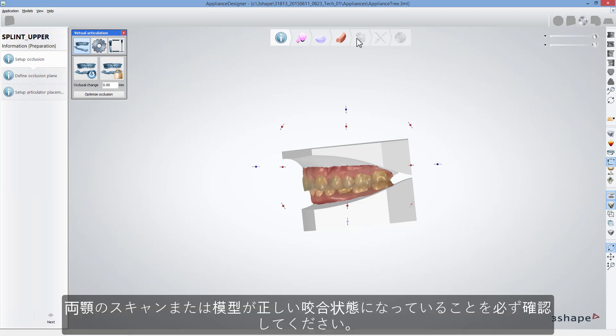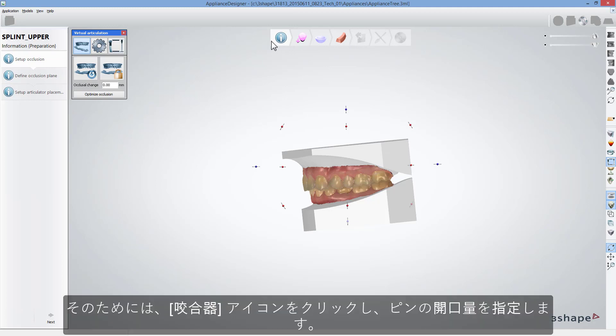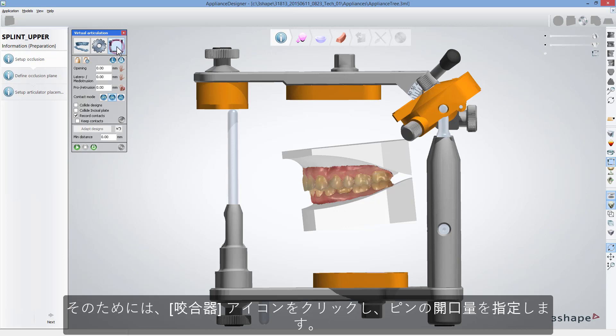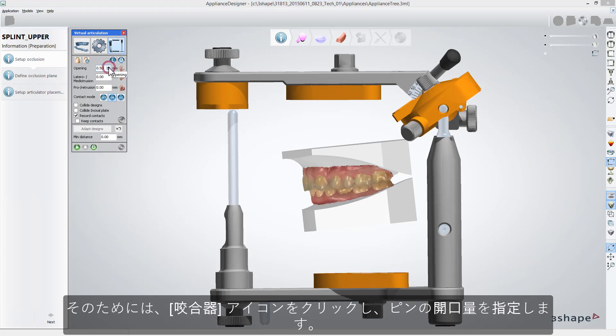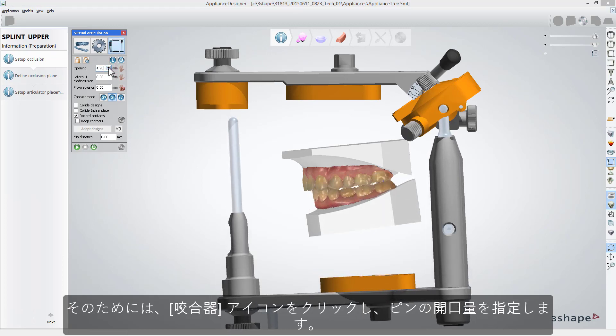Scans or models should be in correct occlusion. If occlusion requires adjustment, for example of opening, that can be done using Dynamic Virtual Articulator. For that, click the Articulator icon and set the opening value on the front pin.